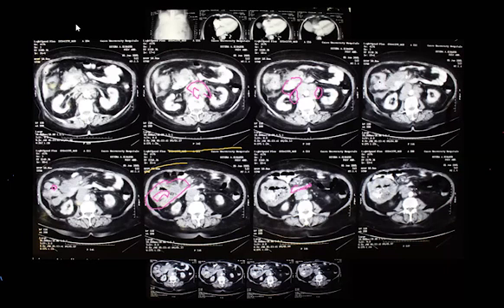احنا بنشوف الحاجات. We're concentrating on CT now. We're not talking about a special system. We'll review the systems later on, but at the moment we're talking about CTs. CT as a modality. يلا نشوف اللي بعد كده يا عائشة من فضلك. شفت احنا سكرين.